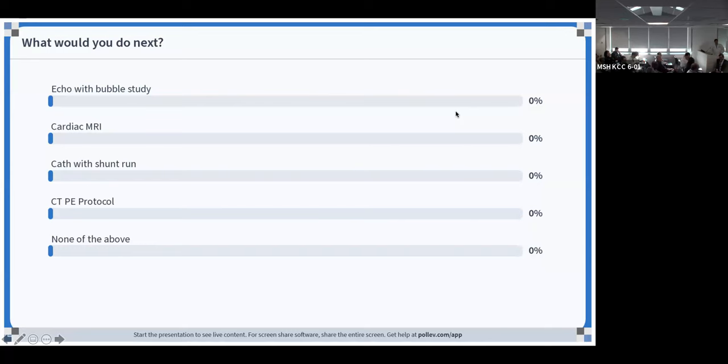And the other thing is looking at the atrial septum from subcostal is one way. Adults, it's tough because they don't have great subcostal windows. So we do right parasternal views. We turn the patient to the right, and instead of looking at what we would do for a left parasternal view, we would do a right parasternal view. And you can see the IVC and the SVC coming into the right atrium, and if there's any atrial septal defect, the septum is right there, so you can see that.